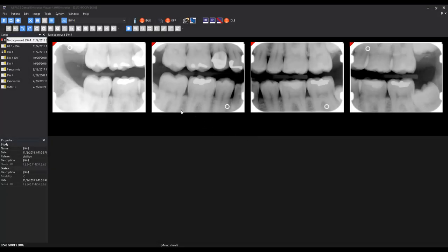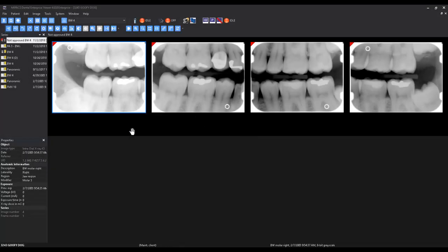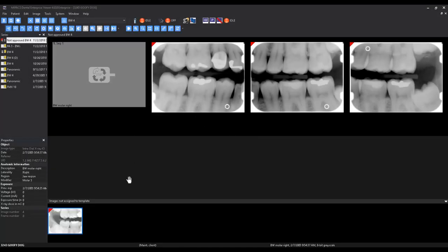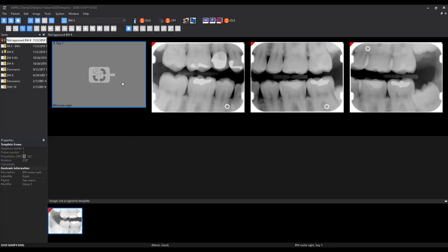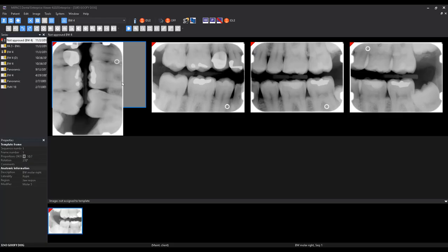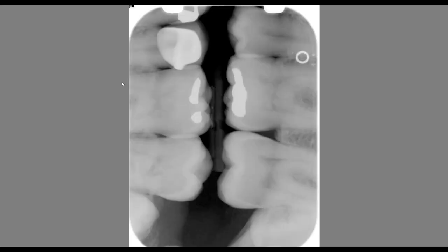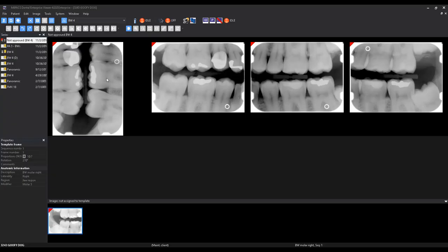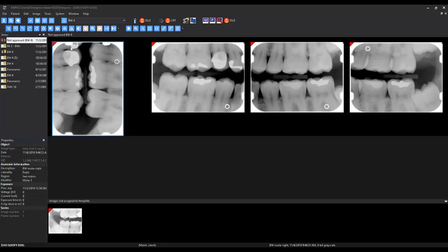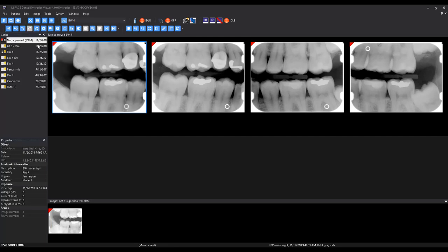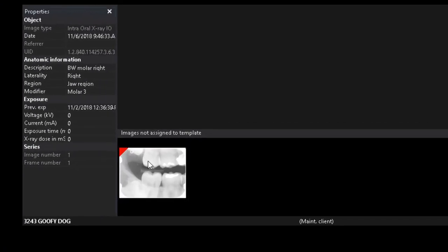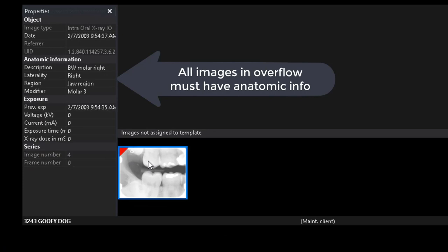After capturing images in a template, if you wish to retake an image without deleting the current images, you may left-click and drag an image from the template down to the overflow area. This will allow you to retake the image without losing the original. Images in the overflow area save along with the images in the template.